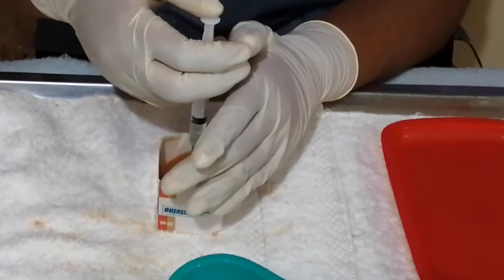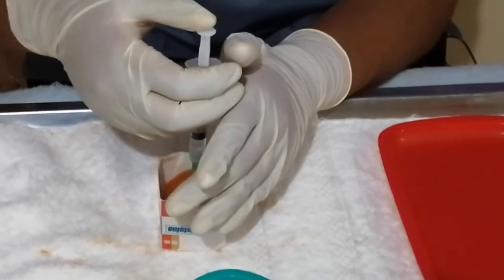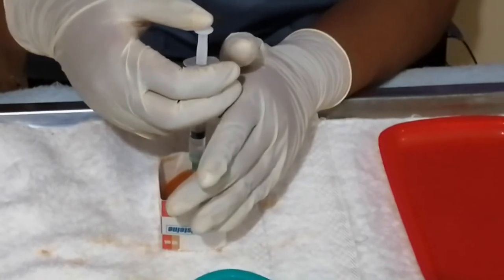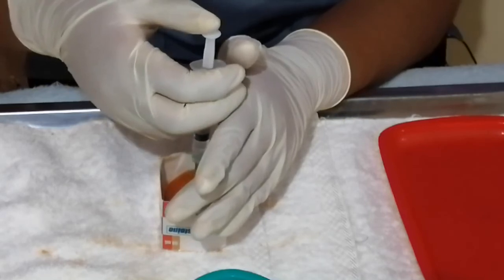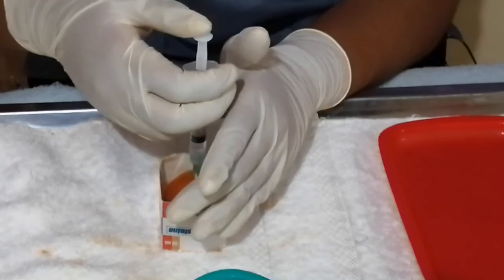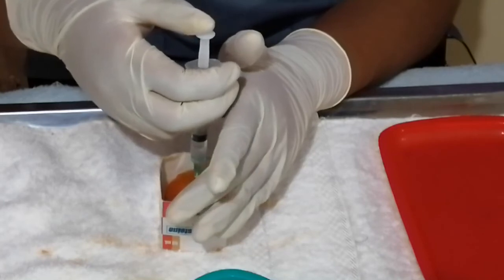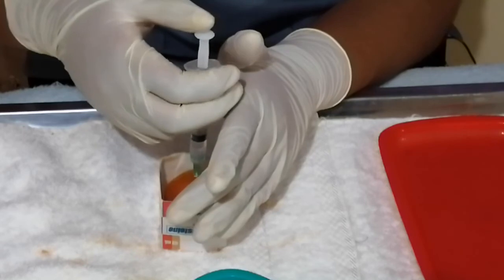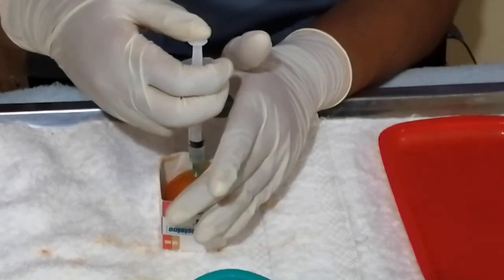Make sure not to push it too hard or push the needle further while pushing the plunger. So continue holding the skin.